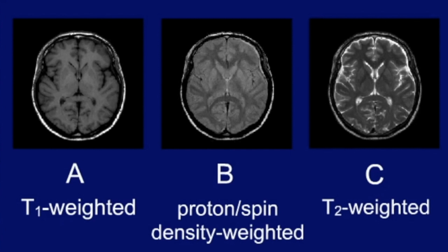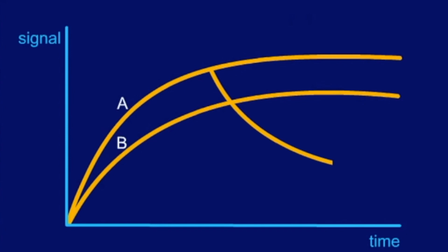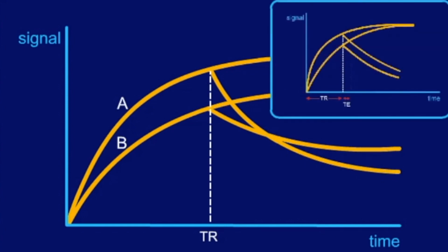Why? Look at this figure. You can see that in this example, the T2 curves start at different heights and cross each other. They do not have to run parallel, as depicted in the previous illustration, which was only done for didactic reasons, as it is easier to understand at the beginning.